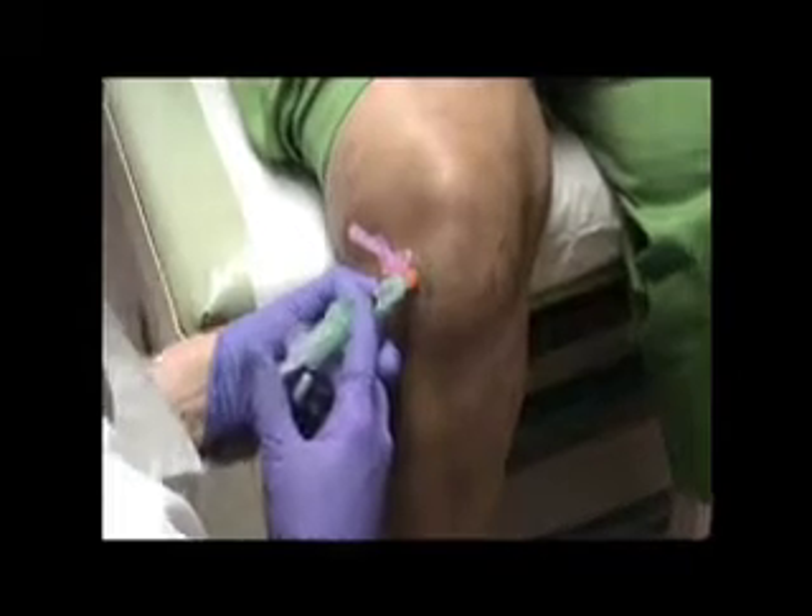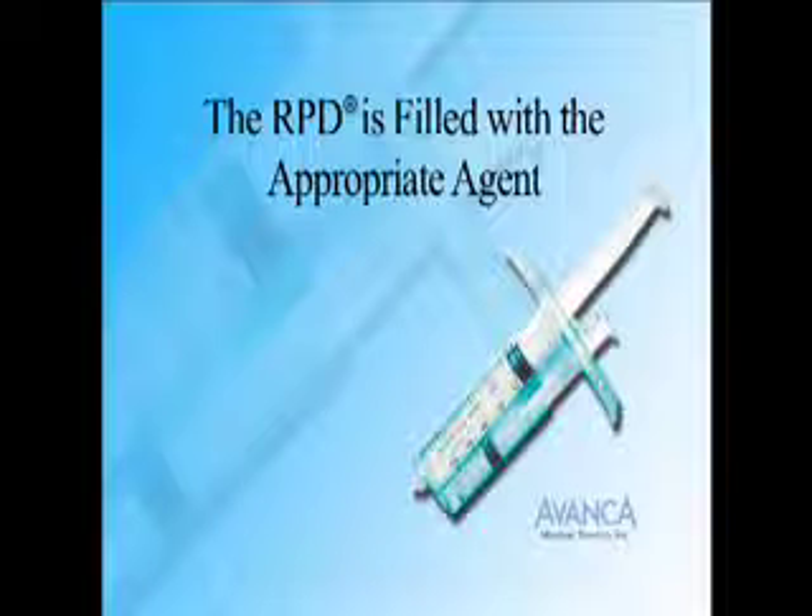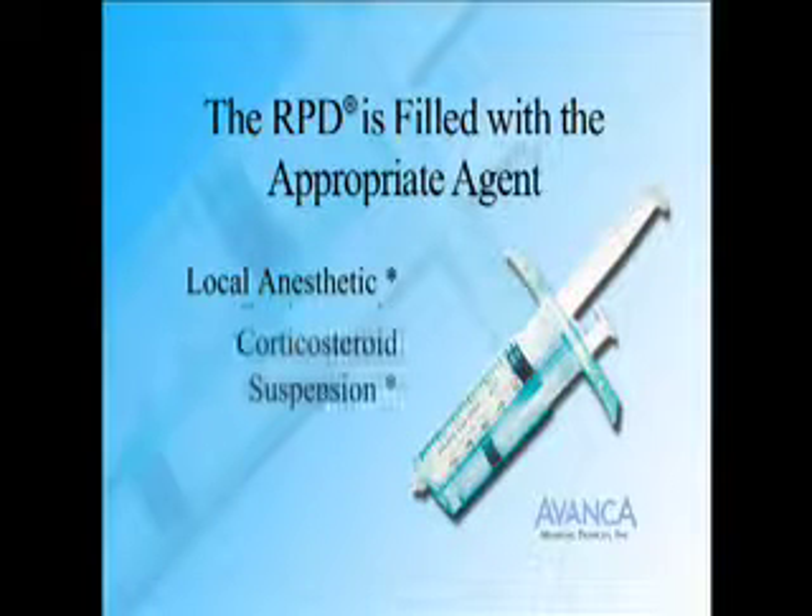The same technique is used for nerve blocks. The RPD can be used to directly inject medications into the joint. In this technique, the RPD is filled with the appropriate agent, which could be local anesthetic, corticosteroid suspension, or hyaluronan.